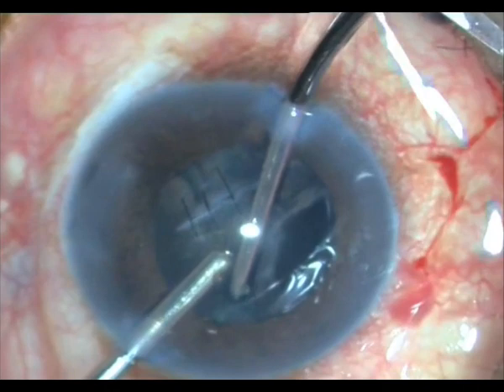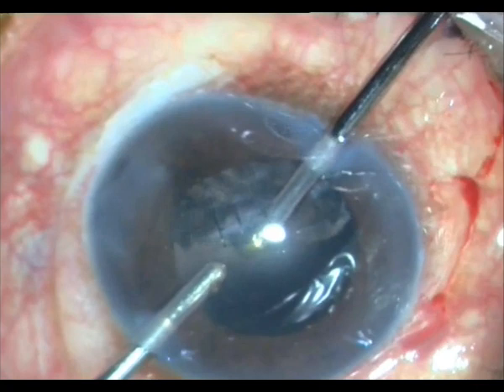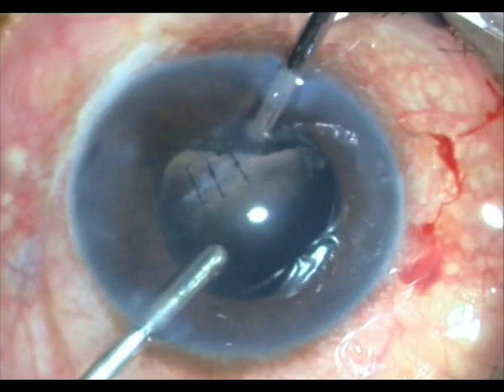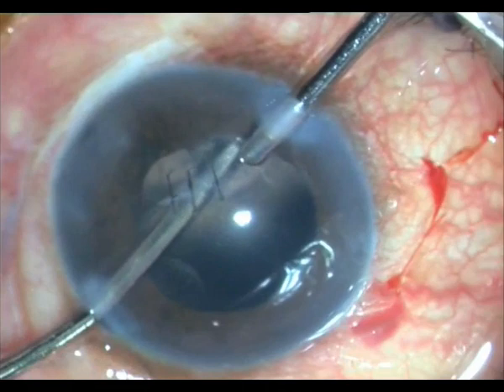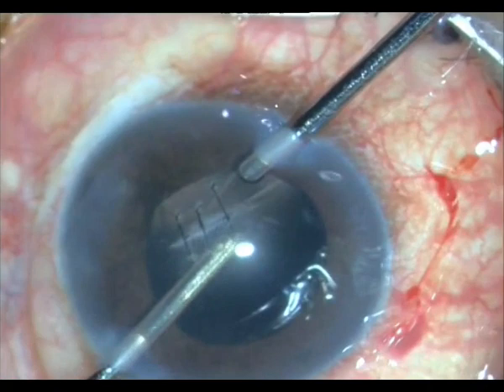I got most of it out. That is the danger area on that side, so I again change hands and approach that area. There is no problem removing the whole thing, and in fact I can even vacuum-polish the capsule behind.